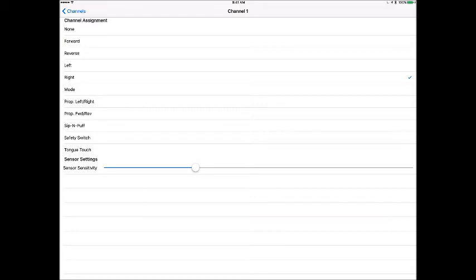A lot of the times what will happen is somebody will tell you to unplug it. All you've got to do is unplug it on our system, and this is the way you would disable it. But by being able to turn off that channel, you're eliminating somebody by chance, and we don't always have control of our environments, going back in there and seeing two loose cables and getting tempted to connect them. And now you've put your child or your spouse back into the chair, thinking that everything's safe, but something got connected back in, and now they take off in a direction that they weren't ready for. So we really eliminated that, and it's just a safety precaution that I like.